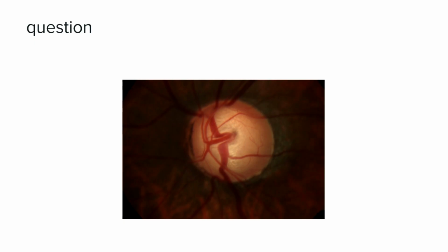Next person. This is an optic nerve head, right side or left? Left side, with a cup to disc ratio. Size of the disc. Size is around 0.6 to 0.7. Disc size. Small, average size. Average or large? Large size disc. It's a large disc. Yes, ma'am.